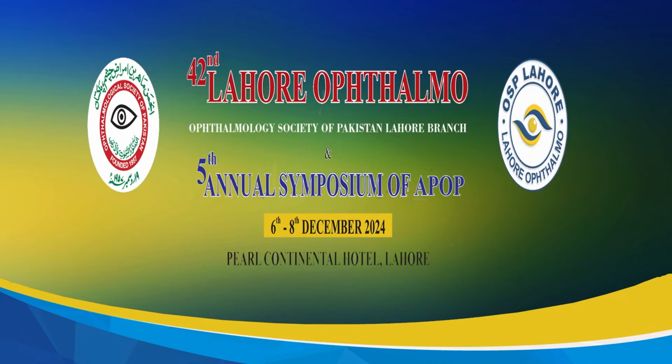Secondly, Kashif did brilliantly with the cutter in one hand and a light pipe in the other. I use 3, 4, 5, 6, 7 port vitrectomies in diabetics. I like to rotate around the patient. During vitrectomies, I sit on the top, I sit on the temporal side, I can even sit on the nasal side. Impossible to sit on the foot side because there's no room.